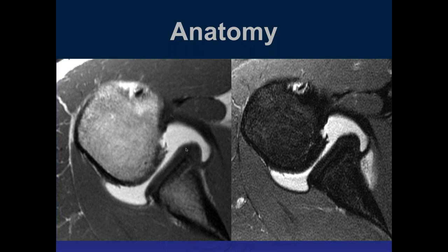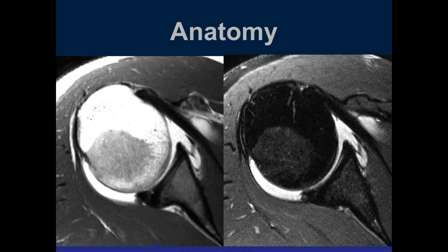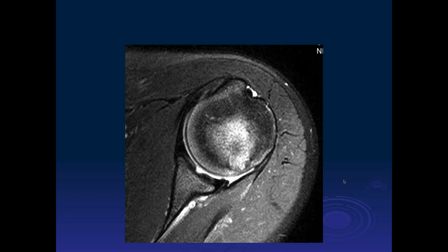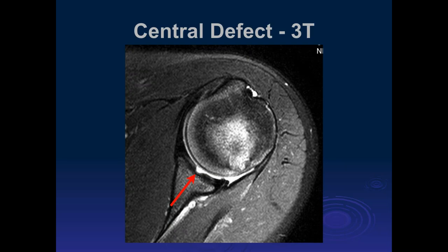In the axial plane, we can see the inferior labrum — anterior, inferior, and posterior inferior — then going up we see articular cartilages and the anterior and posterior labrum. In the coronal plane we can see the middle ligament, inferior labrum, and other structures. Just like in hip imaging, you can have a normal variant — a central defect in the articular surface — which can be a normal variant if it's right in the center of the bone.